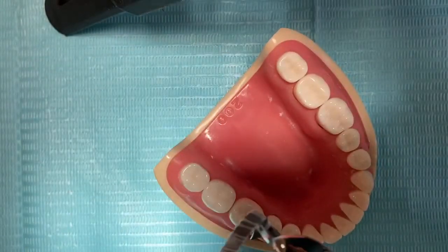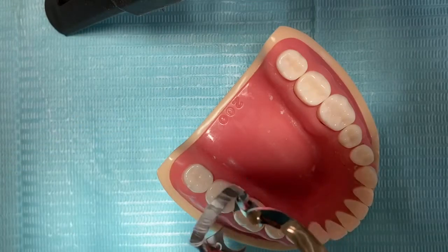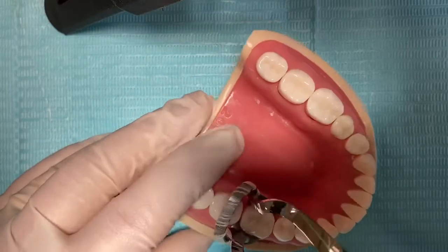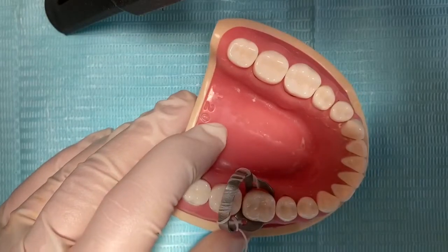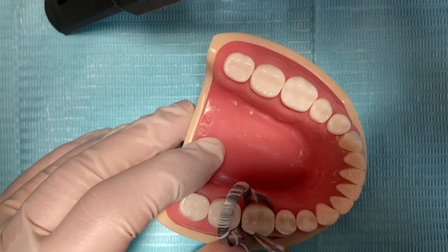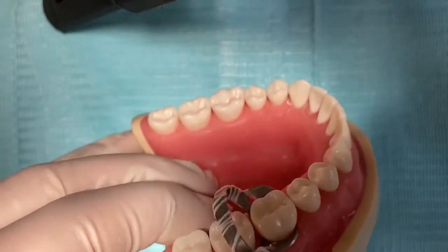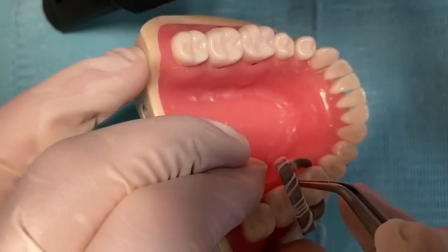To place the clamp on the tooth, our retainer tooth is going to be tooth number 4-6. We press on the forceps to make the clamp bigger, slide it from the lingual surface first onto the buccal surface, and then remove the forceps. We have to make sure the clamp is stable and not moving — the prongs must have four-point contact with the four line angles of the molar. It should not be pressing on the tissue, only in contact with the tooth at those four line angles.